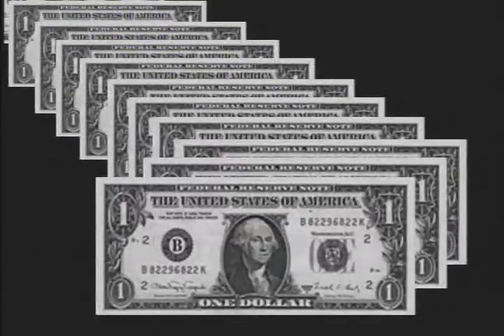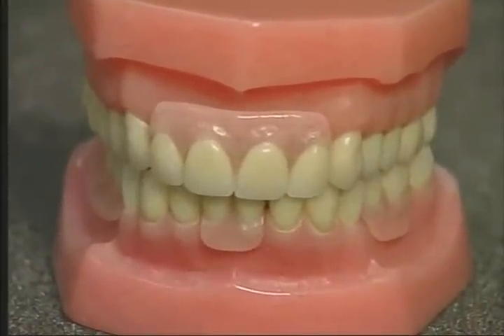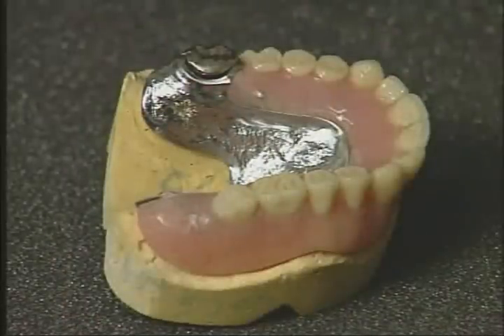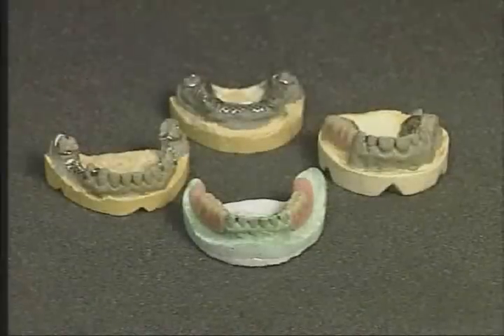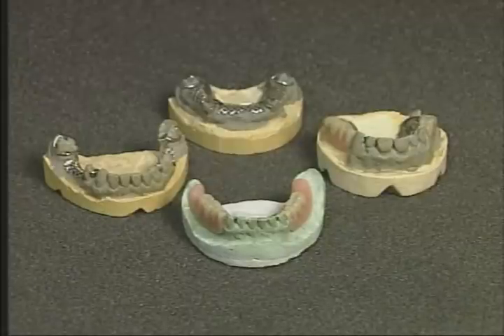Economic questions cause major headaches in all dental offices. Eight, the price must be comparable to that of similar prostheses so as not to be too costly for the patient or the dentist. A simply designed prosthesis with a minimum amount of metal showing can be constructed to fit the pocketbooks of all patients. Nine, the partial must have universal adaptation so that all materials and all teeth can be utilized.